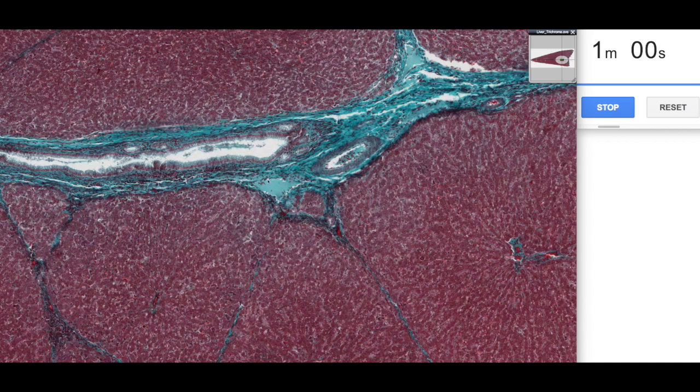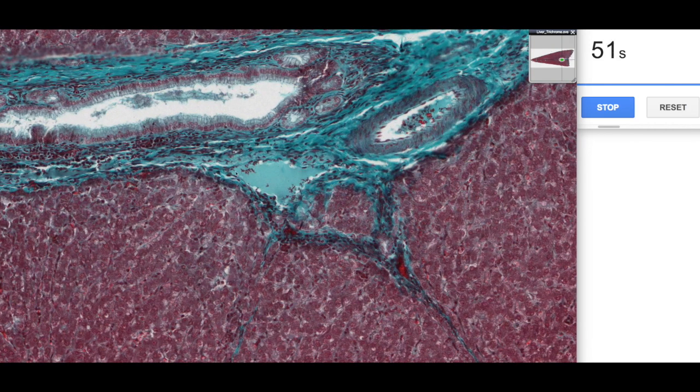The second blood supply is coming from a branch from the hepatic portal vein, and so this is a little venule. And if we zoom in a little bit more, you can just make out the lumen here. So it's not very obvious amongst the connective tissue because it's a thin walled vein.